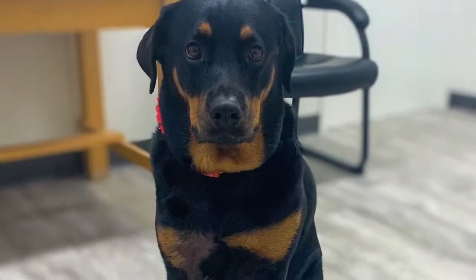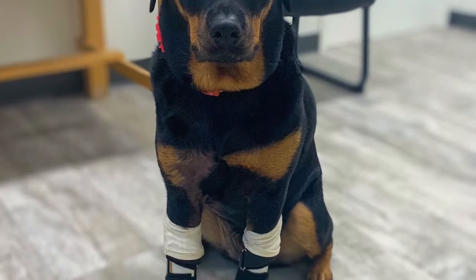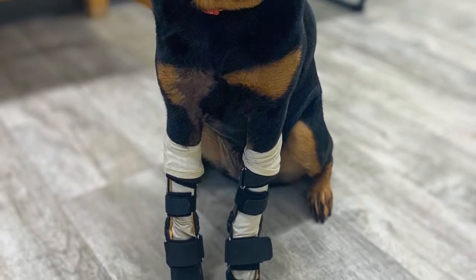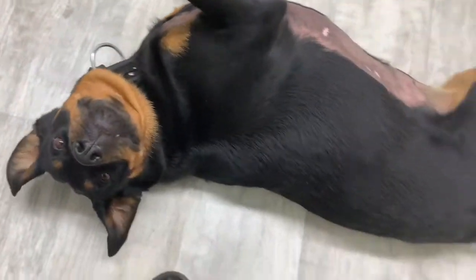About a month into wearing her prostheses, we had to bring Lily in to have her boots resoled, as she had worn down the tread. At the same time, AJ put a wedge on her right boot to help with some gait issues she was experiencing. Lily was, of course, just thrilled about all the extra attention.